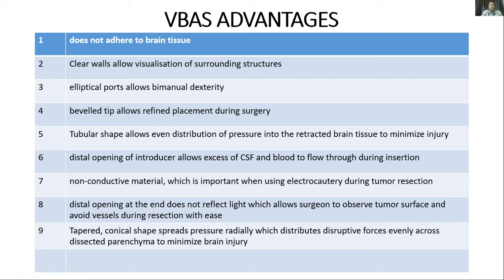Like in many retractors, the distal opening reflects light, so it does not allow the surgeon to observe the tumor surface as well as vessels in that area. So there are chances of vascular injury and injury to normal brain tissue in that case, which is avoided in this.